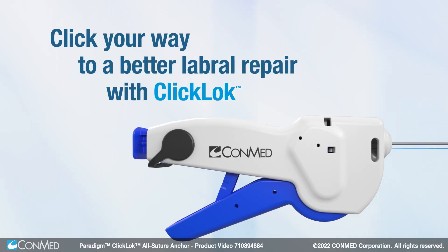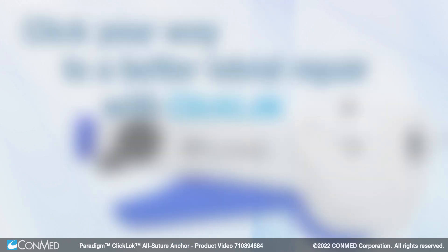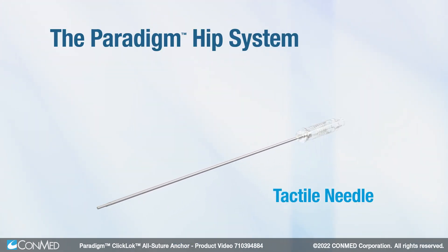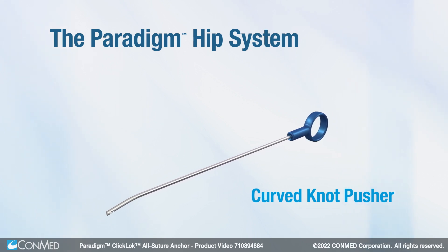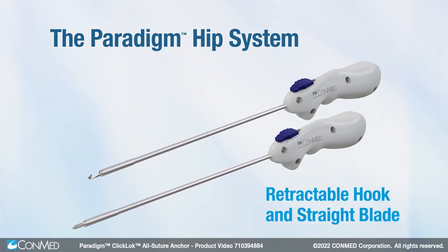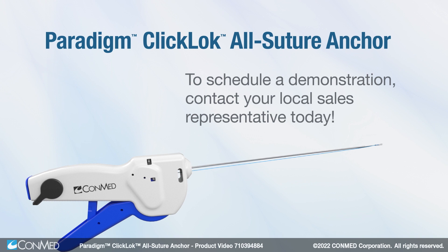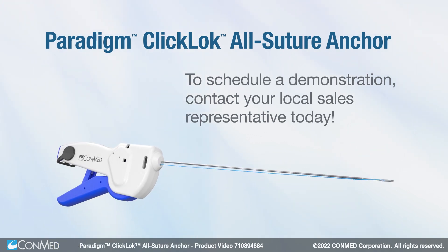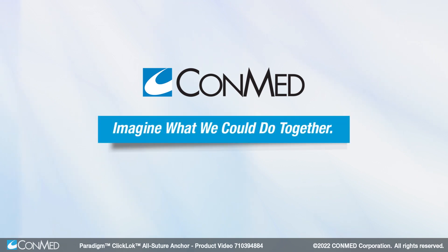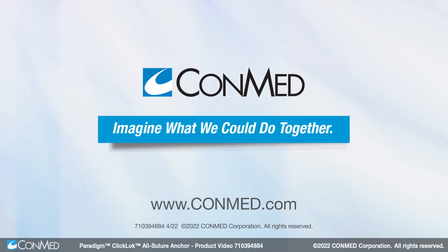Click your way to a better labral repair with Click-Lock. Just one part of the Paradigm hip system, designed by world-renowned hip arthroscopists with safety and efficiency in mind. To schedule a demonstration, contact your local sales representative today. Conmed — imagine what we could do together.